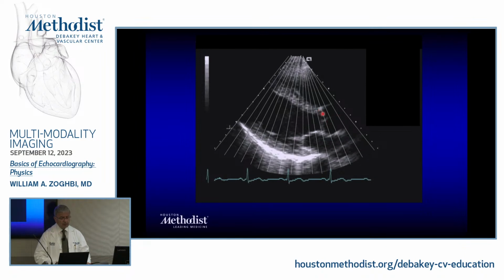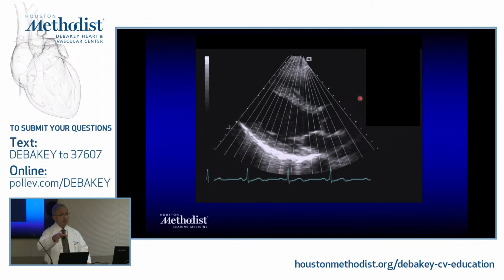But the way the image is constructed is, I have this close to this, close to this, close to all this, and how do I reconstruct it? Well, I know the speed of ultrasound in the body. If I send it out and it goes through blood, and then it hits a certain reflectant structure, for it to come back and be registered by the transducer itself, is going to take some time. And that's how I know depth. Depth is solving an equation of when this reflectant image came back, how long did it take?